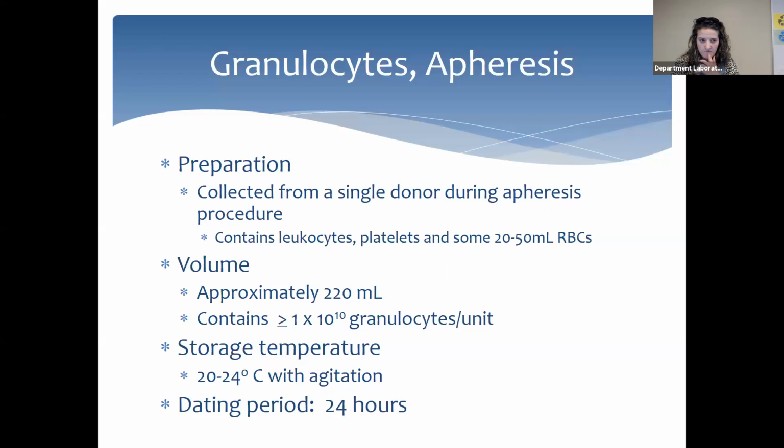When you get apheresis today, you switch out the tubing between donors. It's a whole sterile kit that comes in a plastic bag, and for each donor they open that bag and change it out. Everything is connected, including in the machine. The machine will stay, but everything that is potentially touched by a donor is switched out, and the system remains closed the entire time.